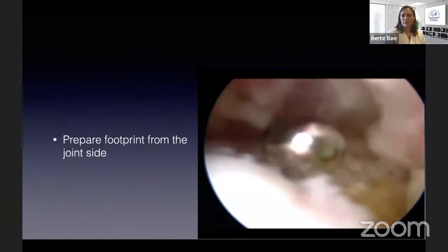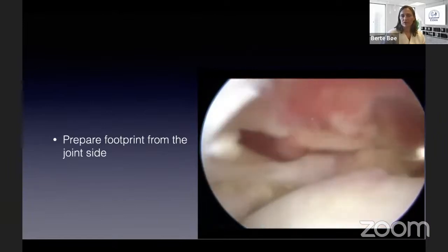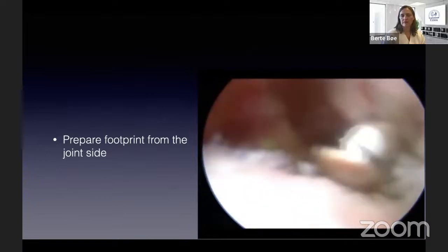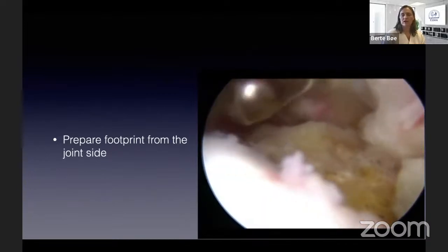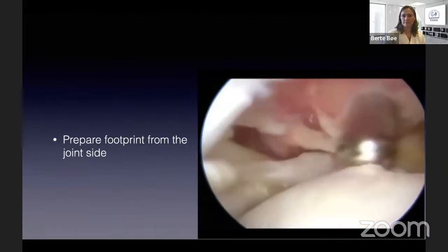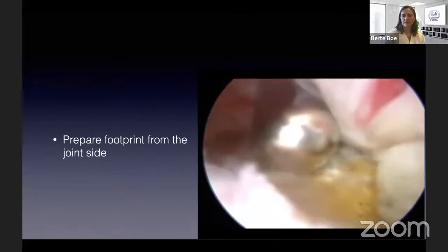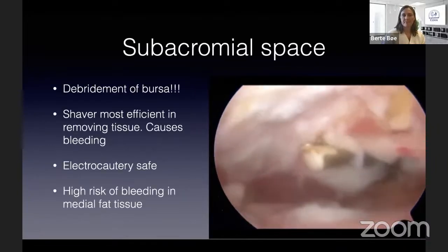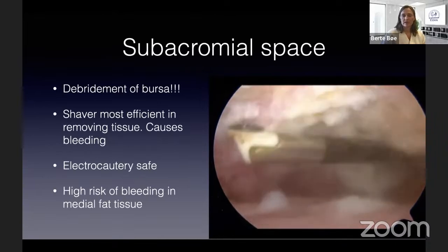So as I told you, I like to prepare the footprint from the joint side. So here the camera is still in the joint and I'm preparing the footprint on the tuberculum majus for my supra- and infraspinatus tear. This is working from a lateral portal. And then I move to the subacromial space.